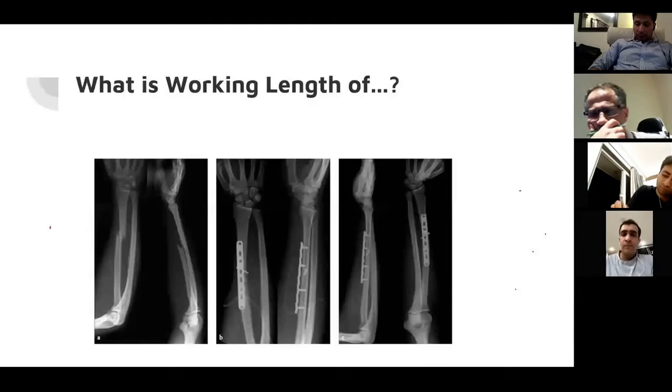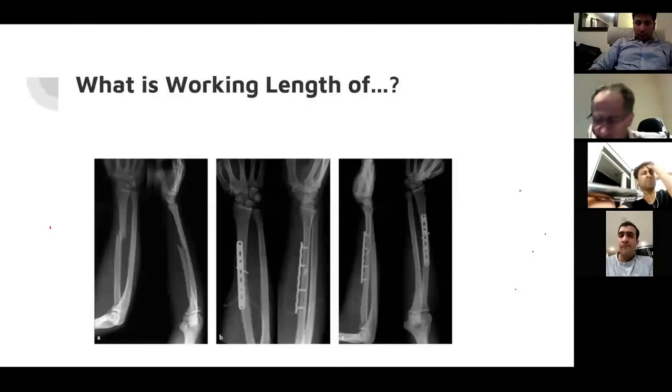Neutralization plates can be used everywhere, wherever we are achieving. What's the most common fracture presentation that you would use a neutralization plate for? It is like an oblique fracture, where I would definitely. I mean, so what anatomical area? Usually the ankle, isn't that correct? The most common. Yes, ankle. Yeah, especially on the fibula.